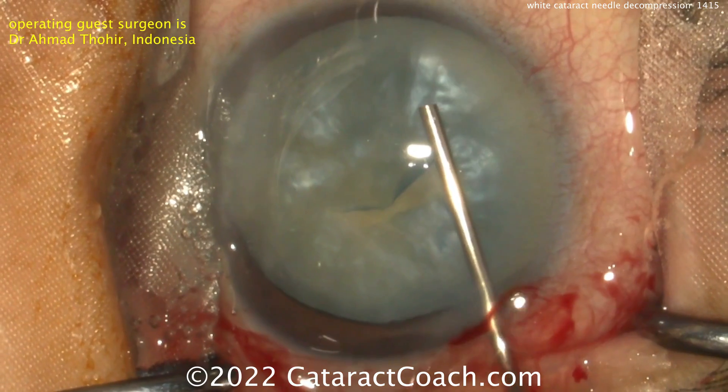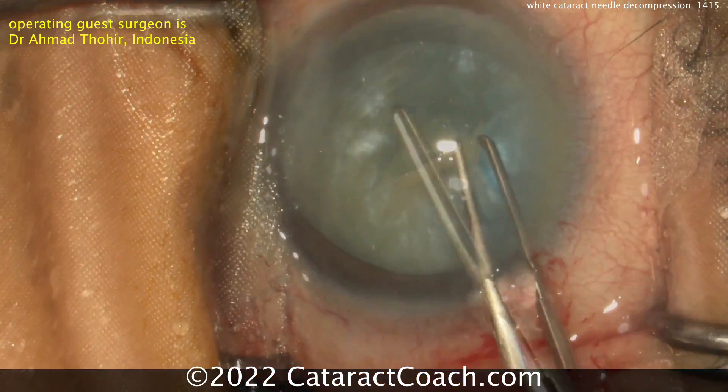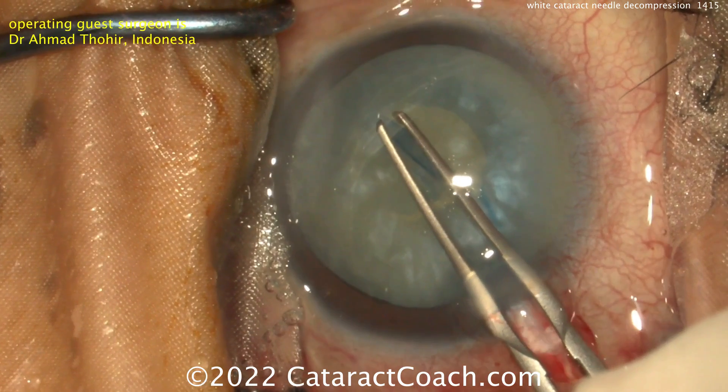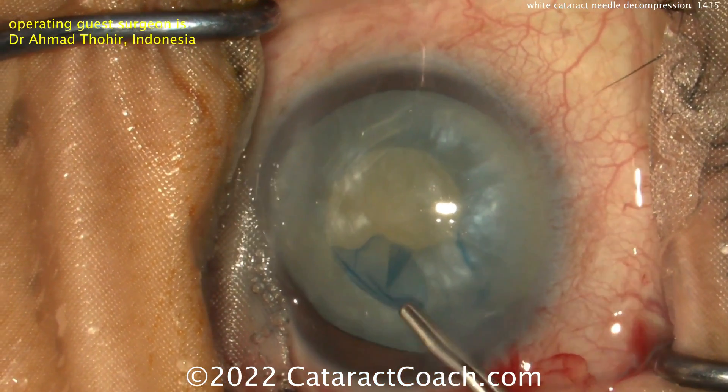Our goal now is to make that capsulorrhexis. Going in with the forceps. Now that it's been decompressed, your risk of an Argentinian flag sign or a runaway capsulorrhexis is much lower. So good control here, getting a nice round rexis.